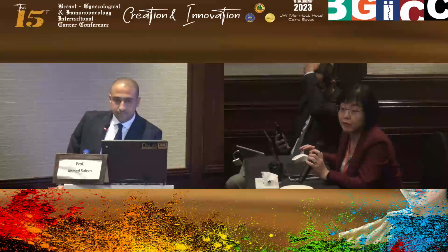Yes. Okay. So I feel that your CTV margin doesn't have to be as extensive, you can be more confident about not having such a large margin if you have 4D CT. But wouldn't you included the motion of the mediastinum? Don't you think that you still need a CTV margin for that microscopic extension?